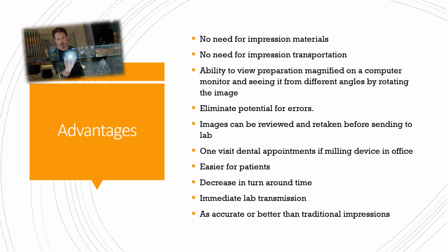I put this little photo up here of Iron Man because I always felt that because I could rotate the image and I could magnify it, it reminded me of his lab and what he could do. And it was a great educational tool for the patient. I could zoom in, I could literally show them their tooth on the monitor and show them what I was looking at, which was so much better than showing them an x-ray because they don't always know what they're looking at when you show them an x-ray.